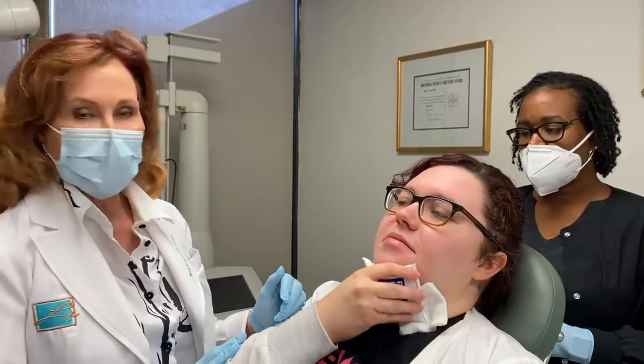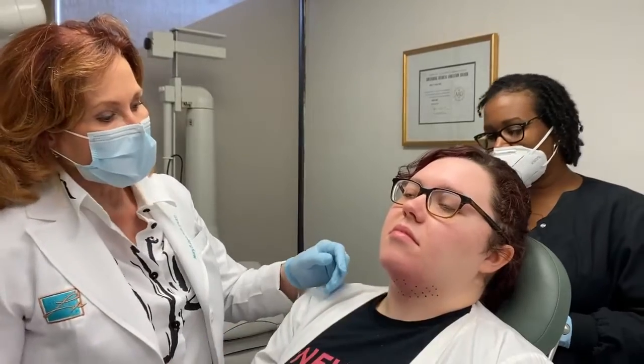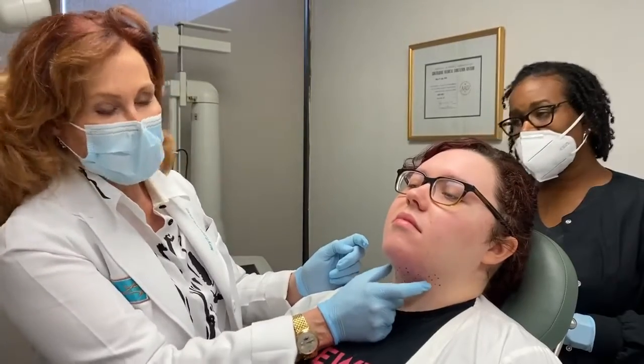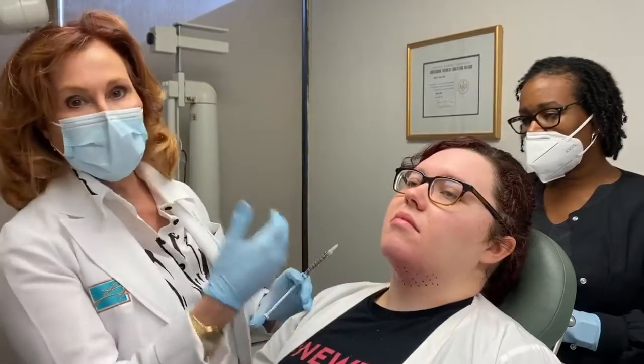We're going to have Kendall lower her hand. As you can see, we've marked the typical dots that we want to use. We like to have the most concentration in the center part of the chin. My assistant is going to be handing me these syringes so that I don't lose my place.